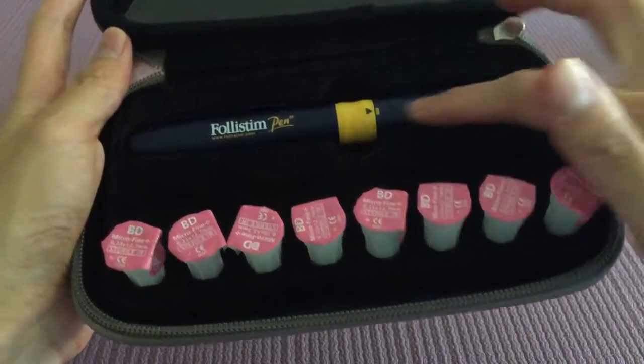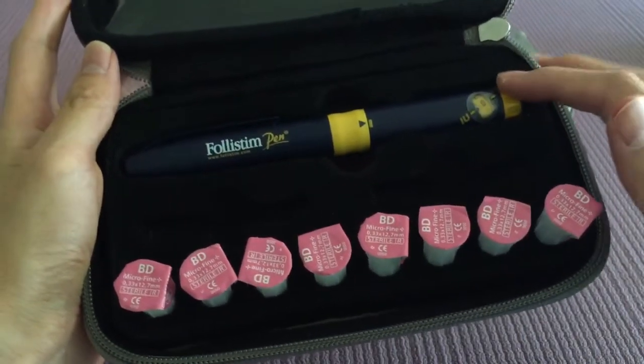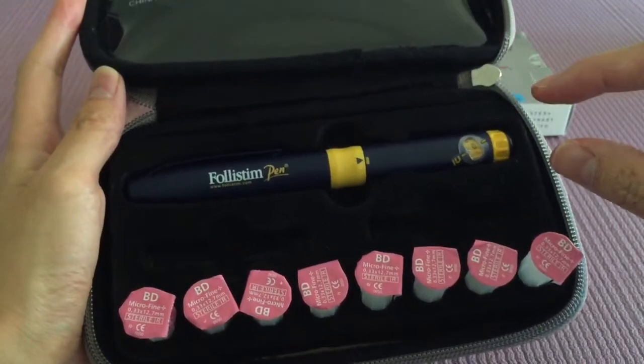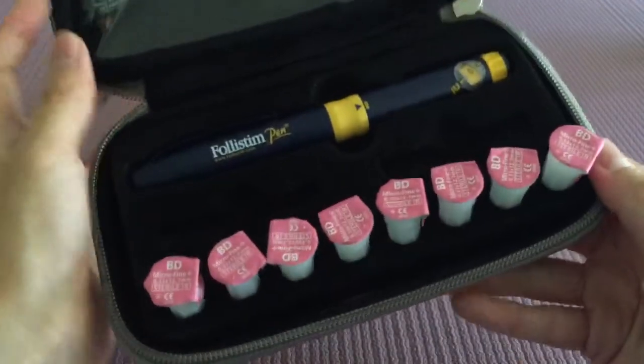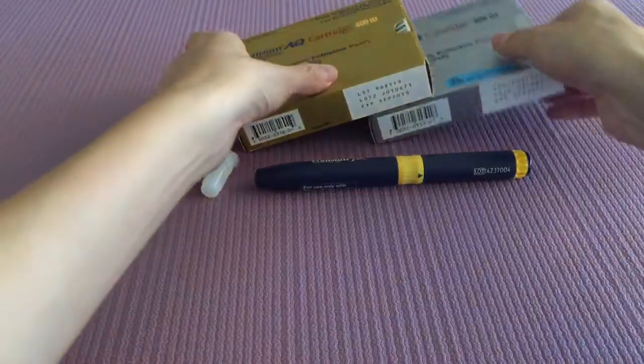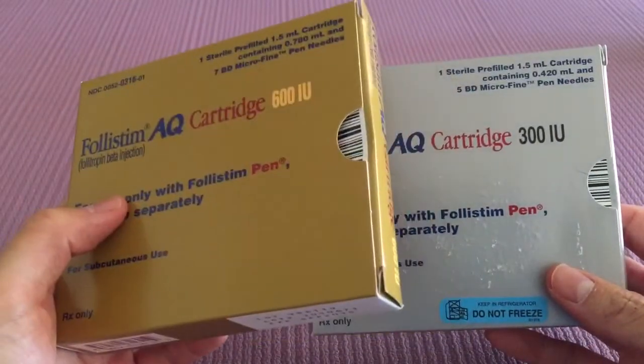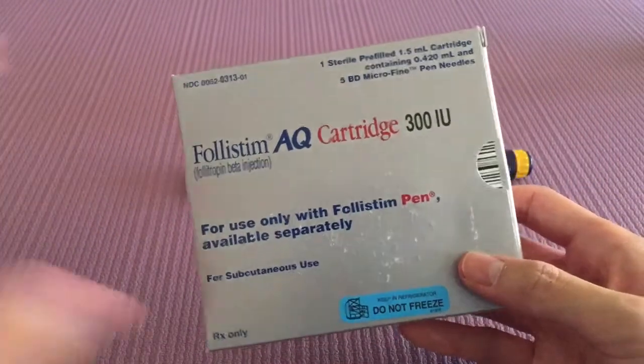There's actually no medication inside the pen at the moment. What happens is you have to buy the individual cartridges and pop them in — that's actually your medication. The cartridges come in different amounts: this one is 600 international units and this one is 300. It really depends on your dosage.